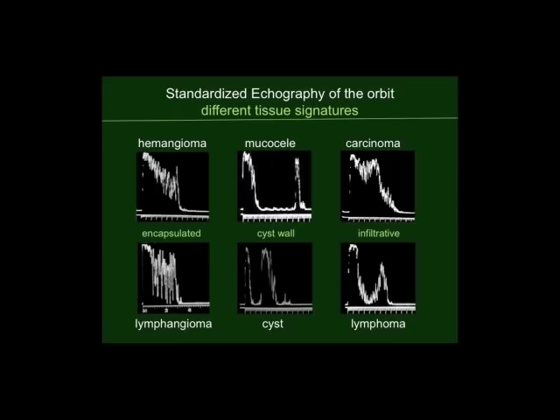Here are six A-scan examples of orbital tumors: hemangioma, mucocele, carcinoma, lymphangioma, cyst, and lymphoma. You see how different they look in terms of amplitude and length of spikes, and in terms of outline — whether it's infiltrative, like carcinoma and lymphoma, or has a cyst wall, like mucocele and orbital cyst, or is encapsulated, like a hemangioma and a lymphangioma.